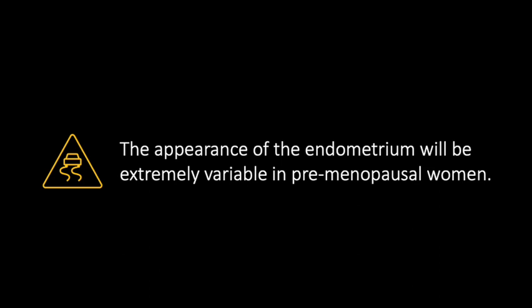As clinicians, when we see a thick endometrial stripe on an ultrasound report, our first instinct is to often move towards a biopsy. However, it's important to remember that the appearance of the endometrium on ultrasound is extremely variable in premenopausal women, and that radiologists reviewing these images may not have the same clinical history that we have if we're doing a bedside ultrasound that helps us explain the findings and normalizes them depending on the patient's history.